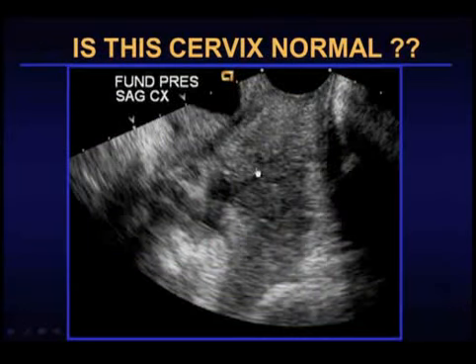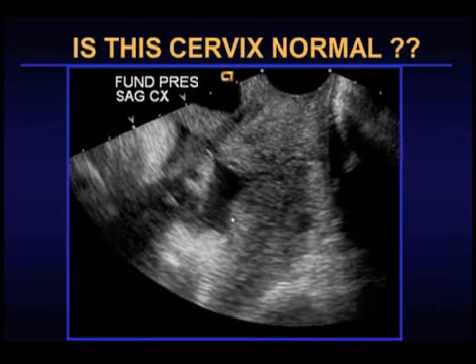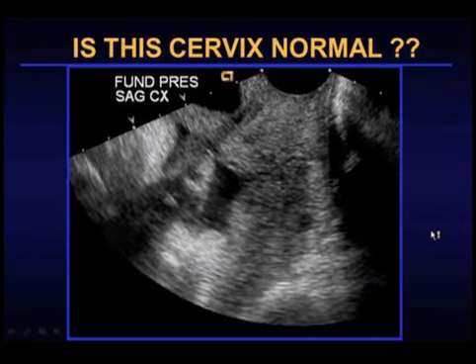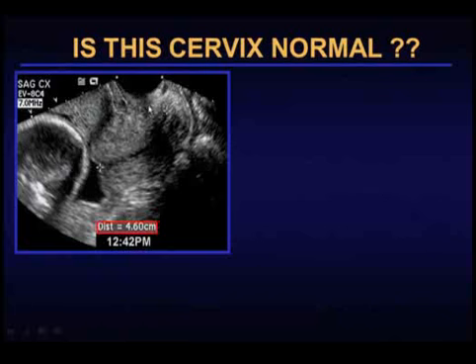So here's an example where the cervix looks relatively okay. Now I'm going to show you a clip as we're applying fundal pressure in this woman. As we do so, you can see how her internal os is starting to dilate and her cervix is getting shorter.